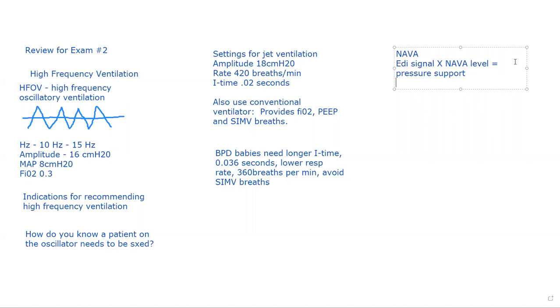The EDI minimum is there because there's always some electrical activity of the diaphragm, even at rest. We don't want that electrical activity to be triggering unnecessary breaths. So we monitor the EDI minimum, and then we also set a trigger sensitivity, an EDI trigger, about 0.5 microvolts higher than that background electrical signal in the diaphragm.